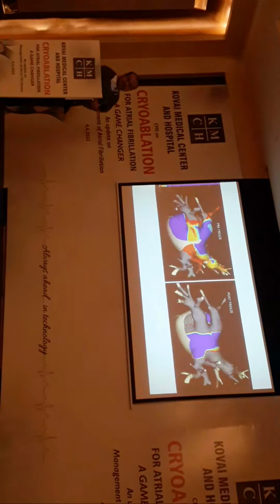You can see the posterior wall of the left atrium. The grey areas are the areas where we have not recorded any voltage. So the pulmonary veins, at the level of the antrum, are isolated from the left atrium. This is one of the biggest advantages of cryoablation. Unlike cryoablation, radiofrequency ablation delivers around 4 millimeter sized burns, so when you make a line across, you have made a 4 millimeter line across the antral area.